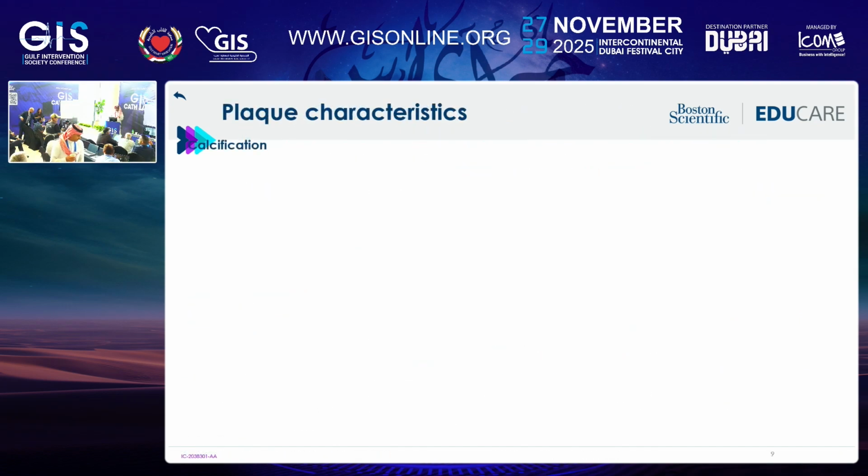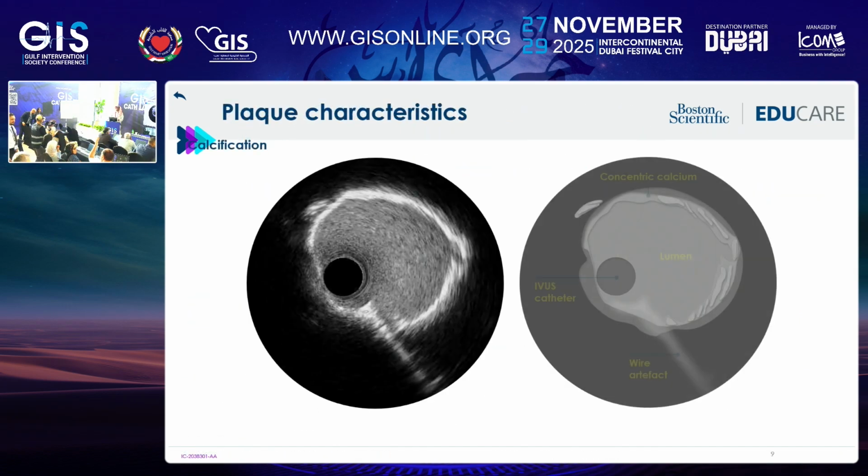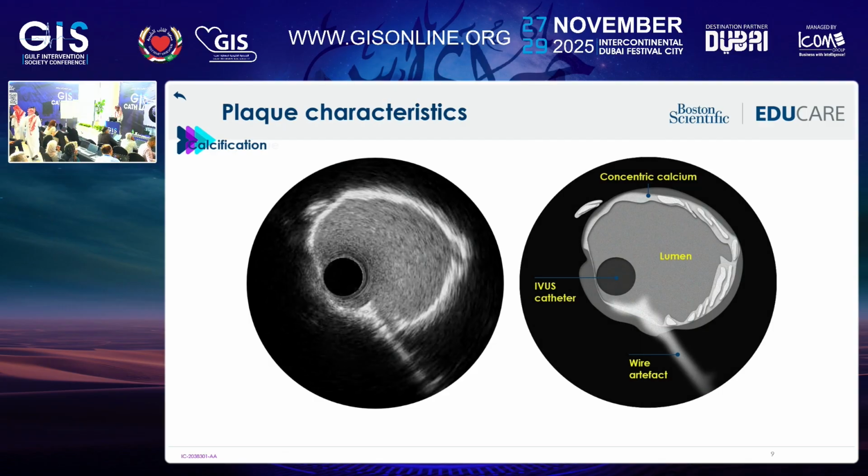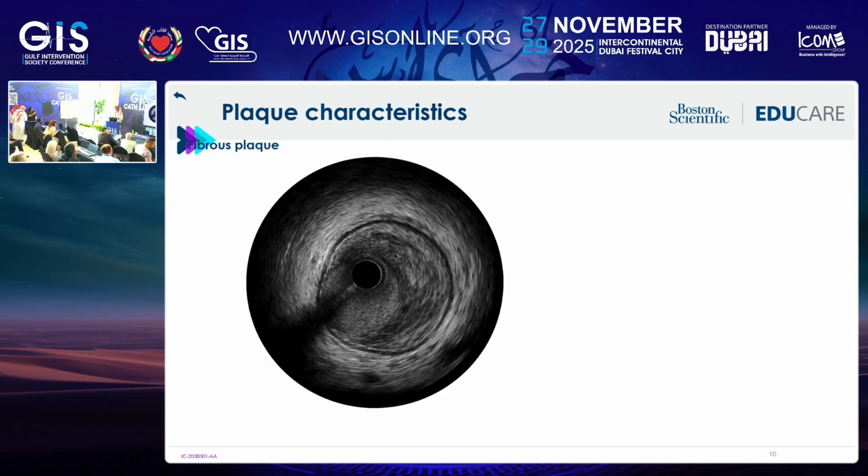So we want to practice. So we're going to discuss the type of plaque, but it is very important for us to quantify calcification. Are we dealing with fibrotic or with lipid-rich plaque? It is also important for us when we use the workflow to make sure that we identify calcific plaque and define the area for measurement.